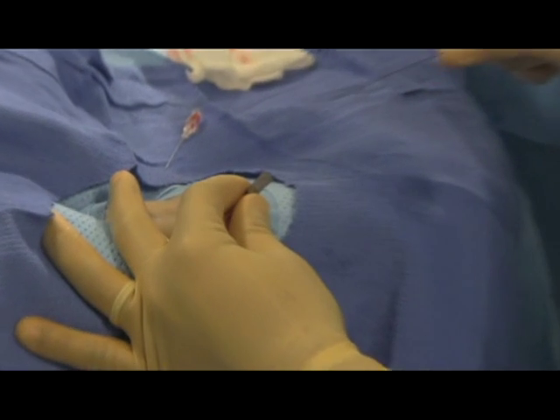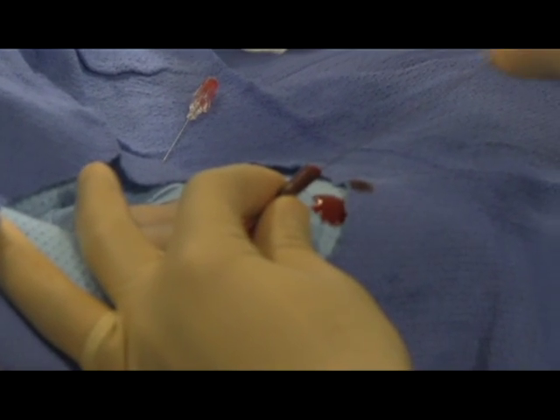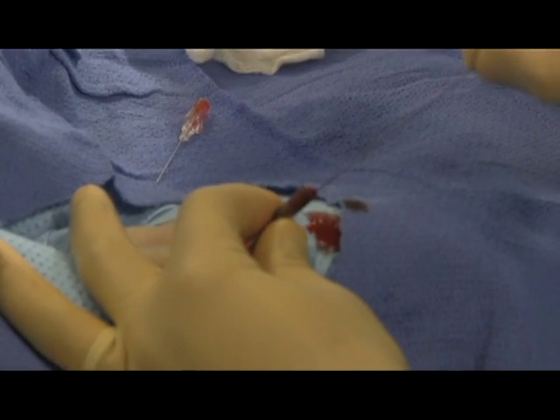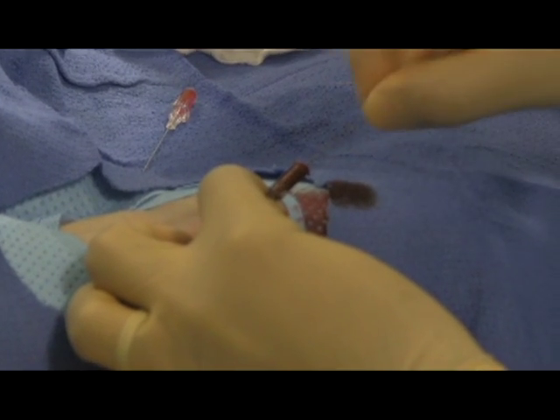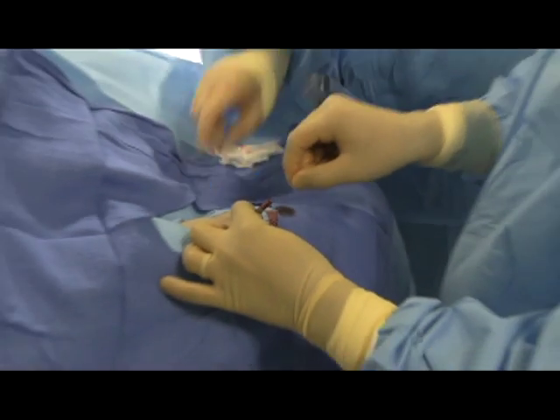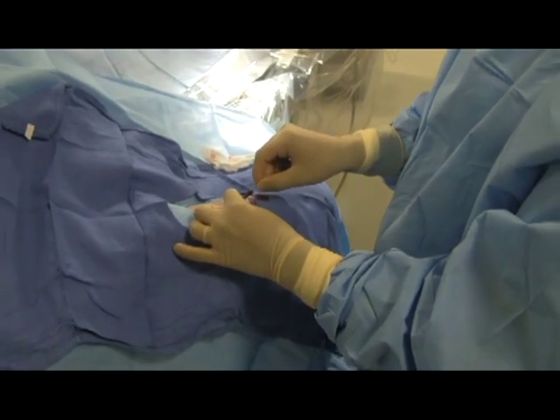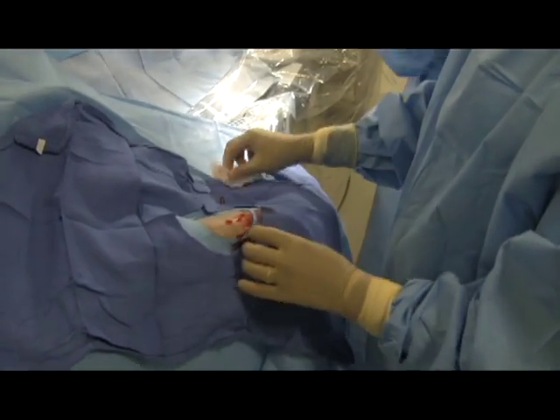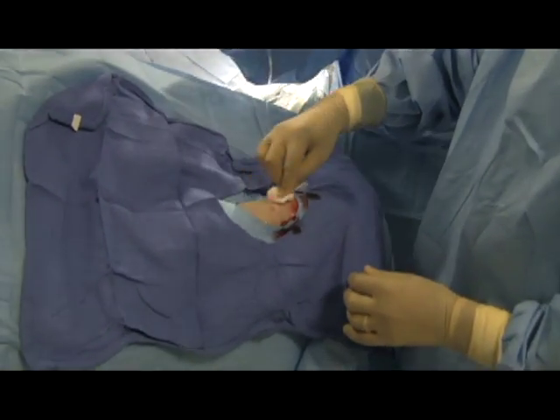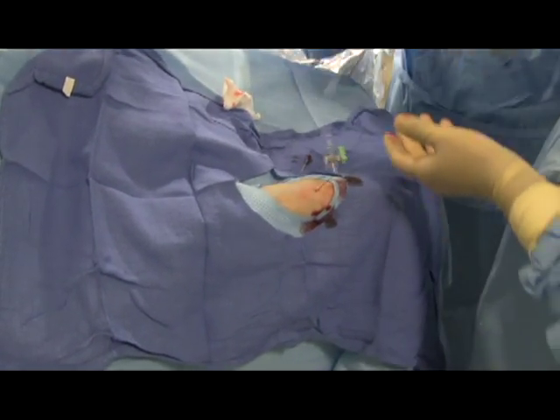Dr. Patel will now cannulate the angiocatheter with a guide wire. Dr. Patel will be removing the angiocath over the wire and inserting a sheath over the wire.